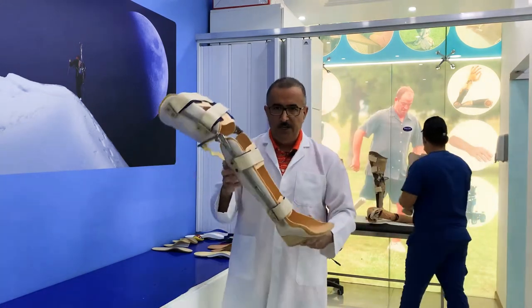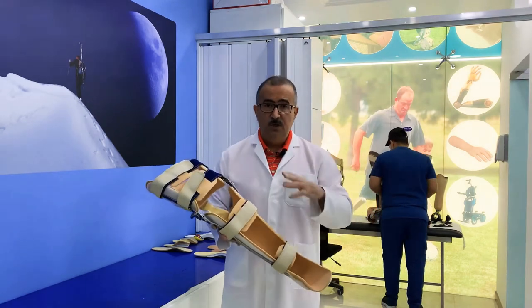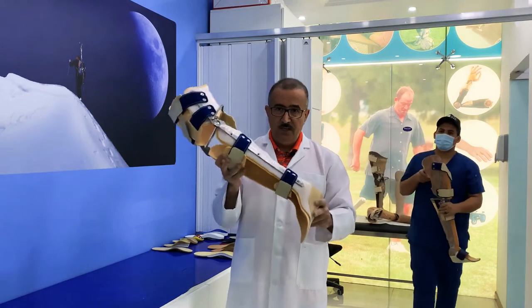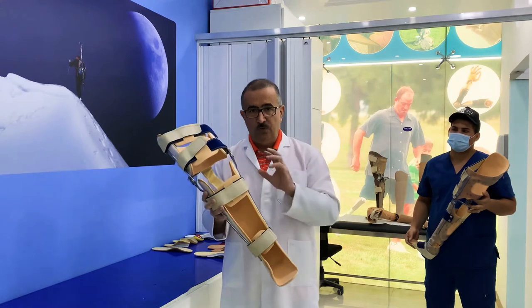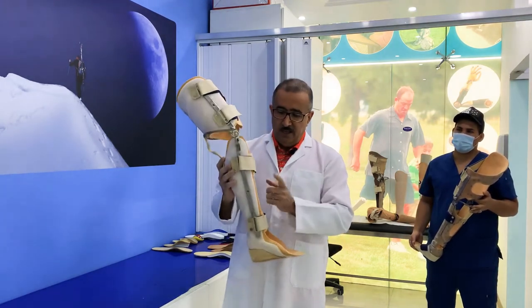Now we will get back to changing from prosthetic to orthotic with KFO for knee stabilization. I have three of them and I will show you one by one.